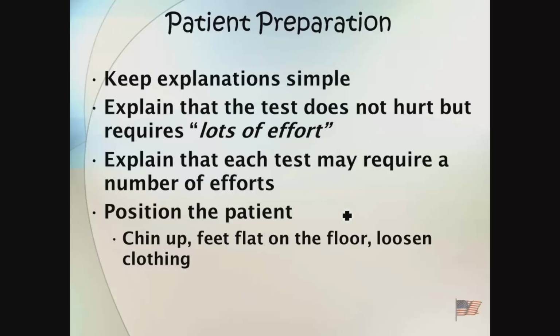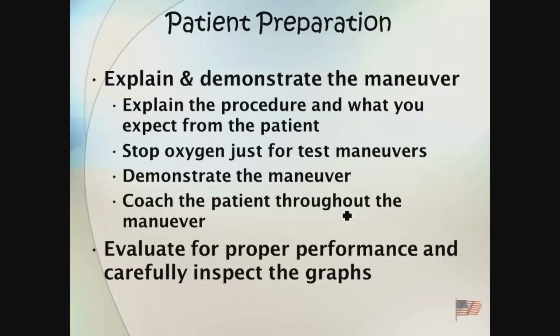Keep the explanations as simple as possible, especially with the elderly. They get confused quite easily. It doesn't hurt, but it requires a lot of effort. And every test is probably going to be repeated multiple times. So it's not that you're doing them wrong, it's just that we need to have multiple measurements. Patients should be sitting with their chin up, feet flat on the floor, loose clothing, so they're comfortable. It's nice to be able to not only explain the procedure, but demonstrate to them what you're expecting back from them.